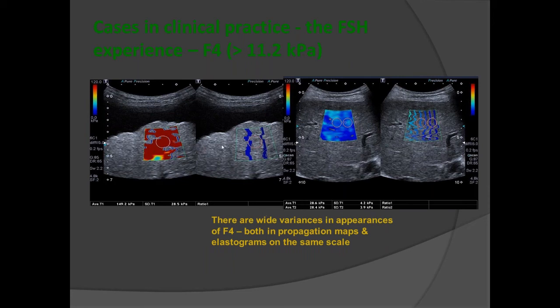It doesn't look like a red, stiff liver, but we go back and correlate these patients and we know they're cirrhotic. So, almost like with colour Doppler, where you get varied appearances of stenoses or hemodynamic patterns, you have to apply the same to elastography. My only advice really is that the more you do, the more comfortable you feel with them.